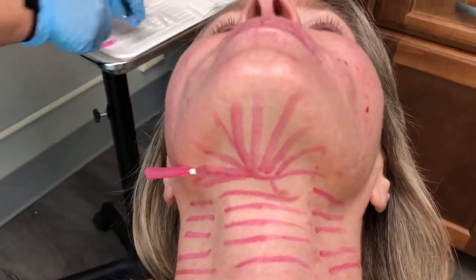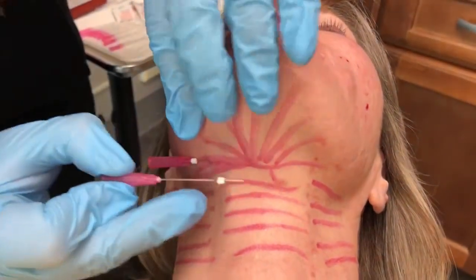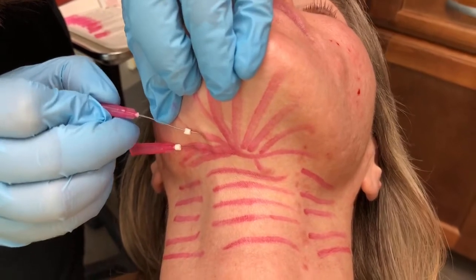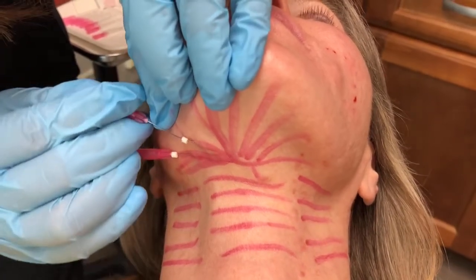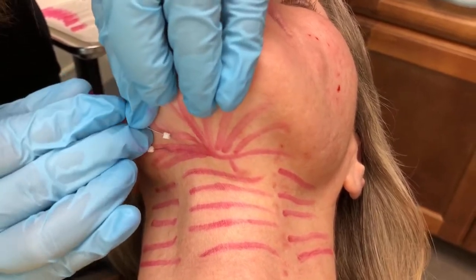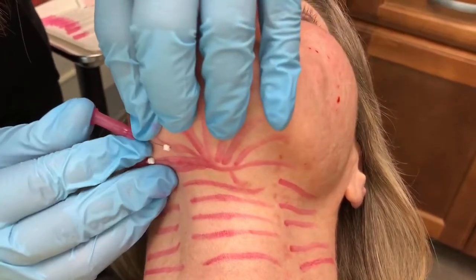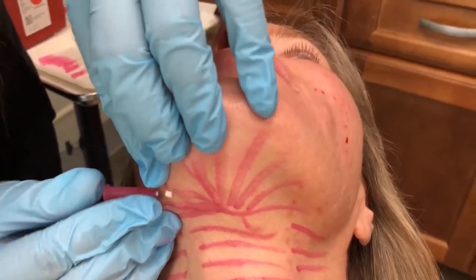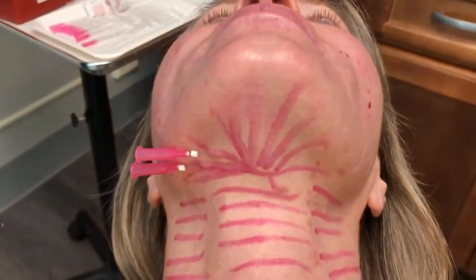We are using solid filler smooth PDO threads. These are 29 gauge by 40 millimeters. We want the longer smooth PDO threads because we want them to cover a bigger area. Here's what we call a half moon pattern, a half star pattern, and we are going to go ahead and place a number of these threads.